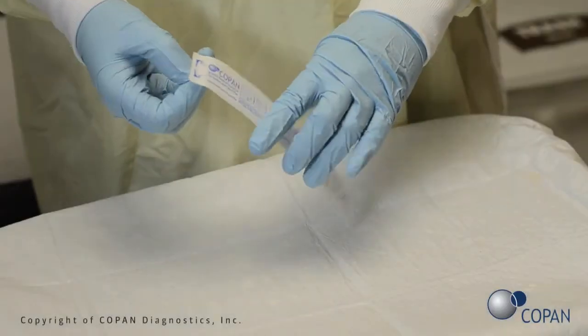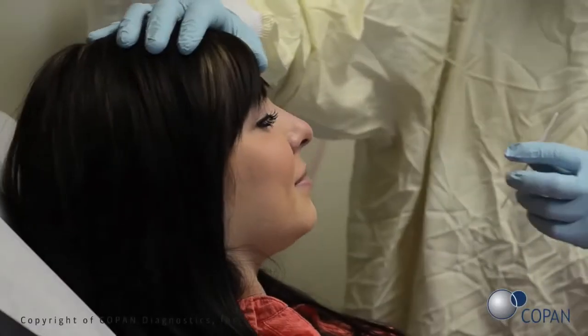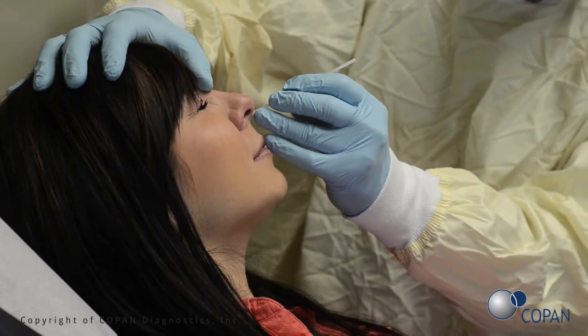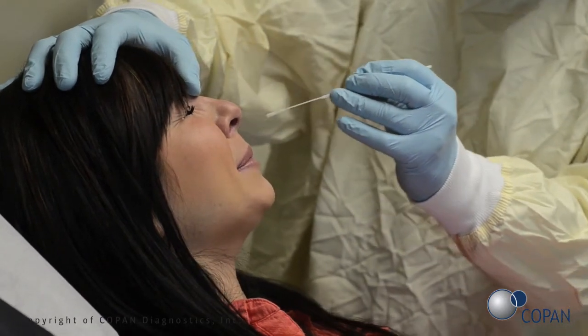Open swab package. Gently insert the swab into the nostril. Using a gentle rotation, push the swab until a slight resistance is met at the level of the turbinates. Rotate the swab several times against the nasal wall. Gently remove the swab and perform the test according to the manufacturer's instructions.